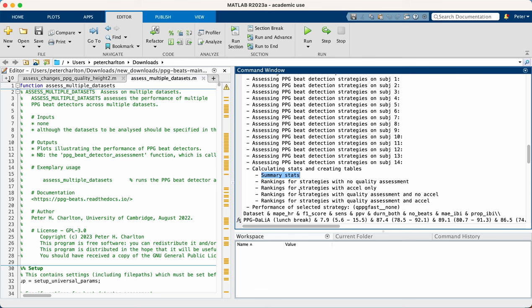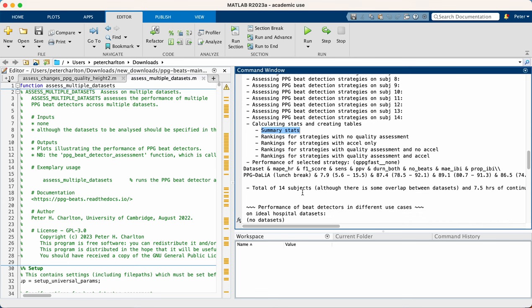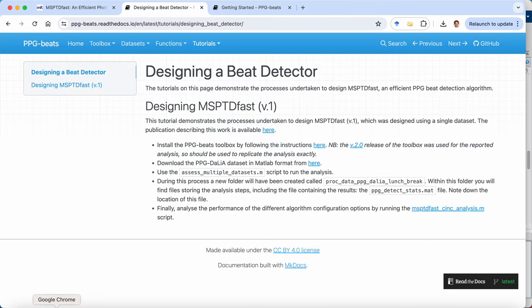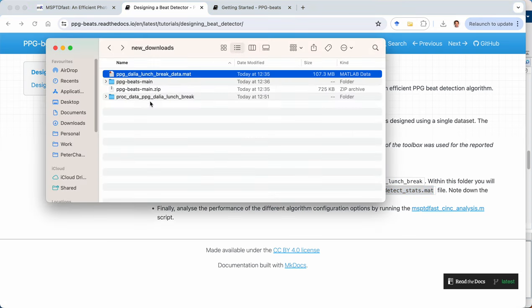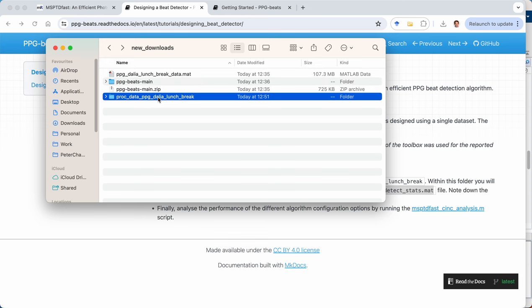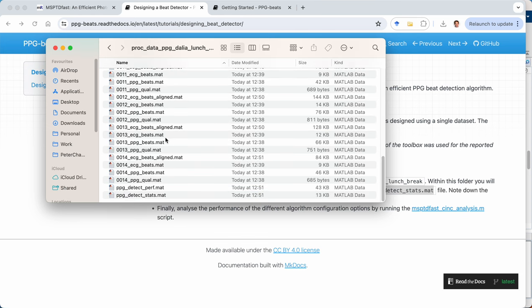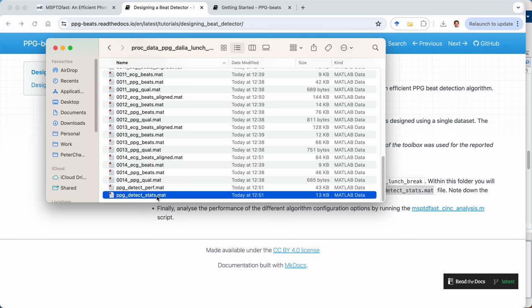And the toolbox then did go on and take a few additional steps, and it bumped into an error later on. But we don't need to worry about that. We're looking at these summary statistics. So coming back to our instructions, we're now on the fourth bullet point. And the file which contains these statistics is this PPG detect stats. Now this is located within a new folder that the toolbox has created, which contains the outputs from each step. And you can see this file is here.